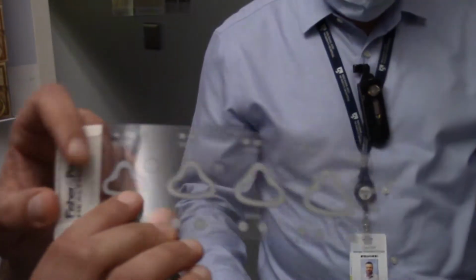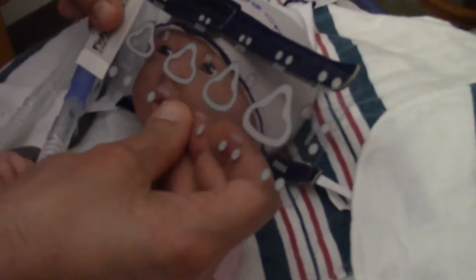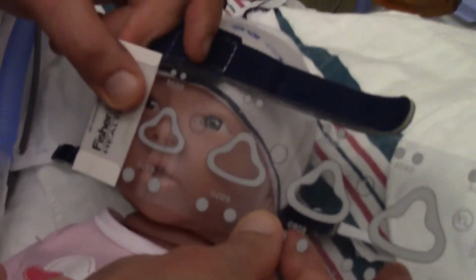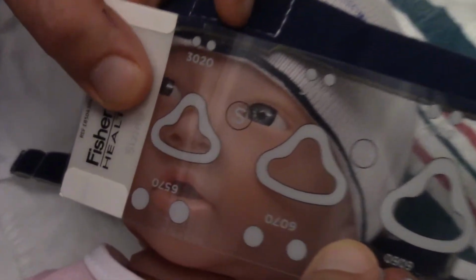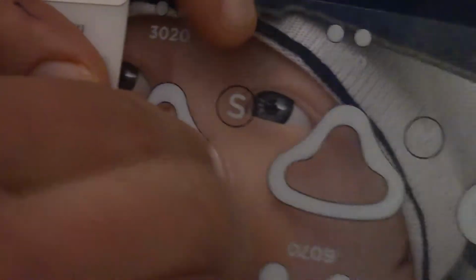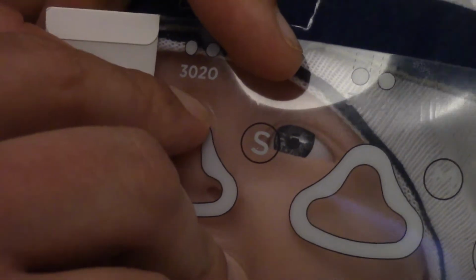So how we want to go about it is we want to take this, and you can see it has small, medium, large, and extra large. So those are the size of masks that we have. So if we put a small over the baby's nose, we can see that we can just barely get below the nares, but on the sides we're pinching the nares, and the bridge of the nose, the top of the mask, isn't even on the bridge of the nose, and that's kind of our target area.